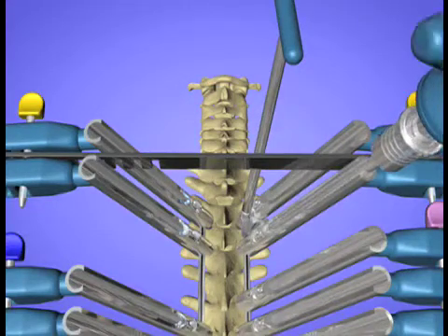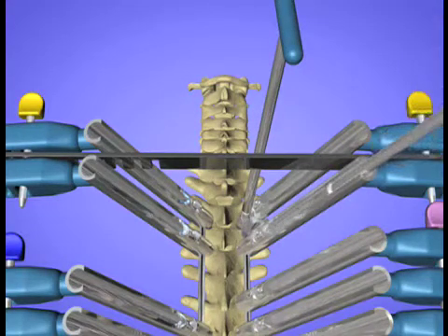The two plugs are tightened provisionally, then the wedge distractor is removed.